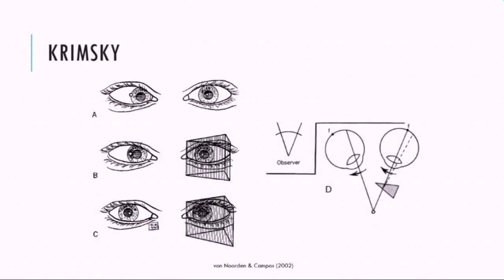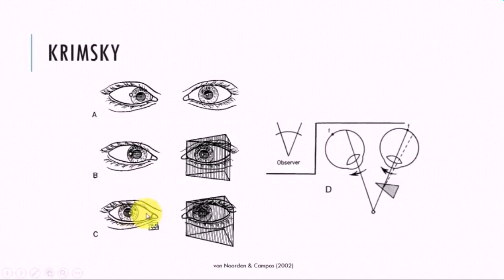With the modified Krimsky, we put the prism in front of the fixing eye. Here we see a patient has a right esotropia and the left eye is the fixing eye. When you put the prism in front of the fixing eye, the corneal reflection in the deviating eye will begin to move and centralise. We can see that it was here on the margin of the iris with no prism, and now with the base-out prism it's getting closer to the pupil. The orthoptist finds the correct prism to bring it into the centralised position — and what we're really expecting is that the position of the corneal reflection in the deviating eye should match the position of the fixing eye before you began testing.